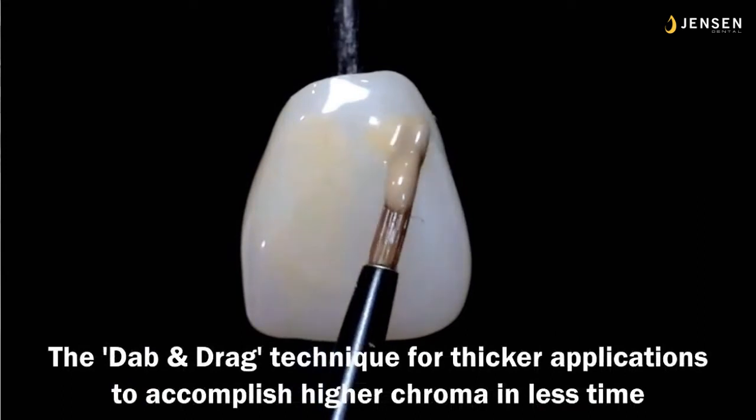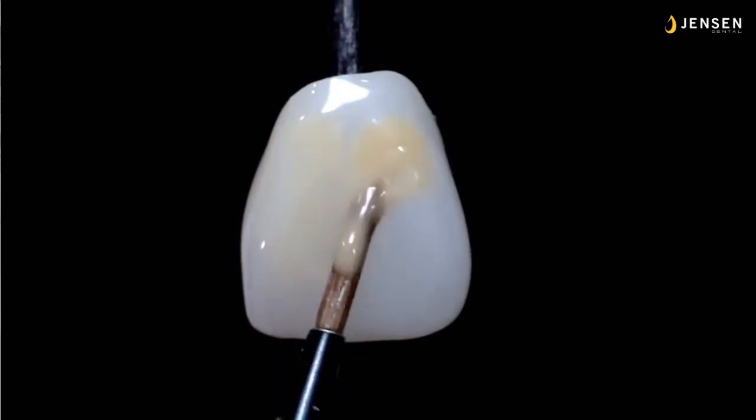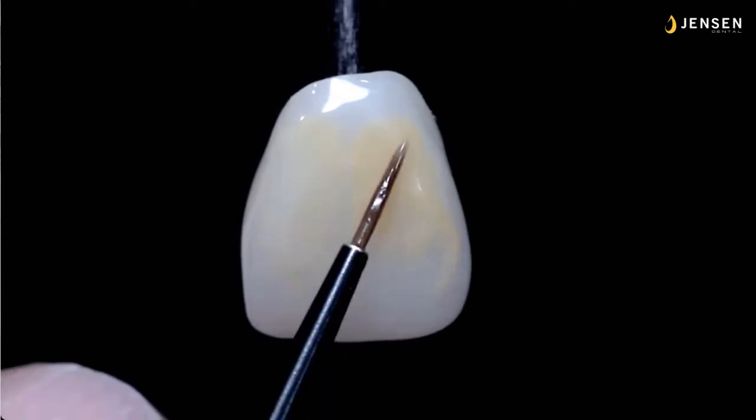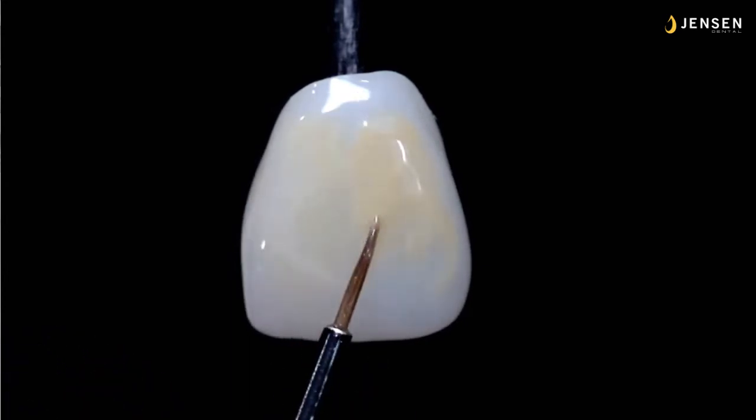Now there's a thicker amount there. I didn't thin this down, and this is the dab and drag technique. Think of it kind of like when you're filling an impression with die stone. And what I'm doing is I'm kind of vibrating it and letting it flow off the brush. This is why you have a little bit of the glaze liquid in your brush. Very little, just enough to make it damp, not enough to make it soupy. And yes, that was dirt on my crown. I edited it out when I took it out.